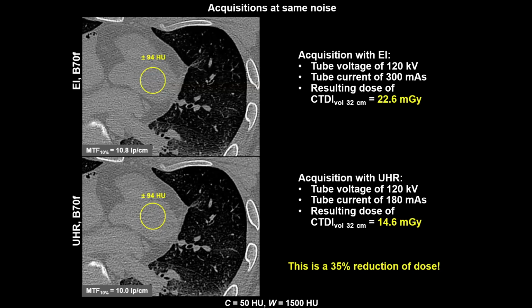As I already said, every patient can already benefit from this. Usually medical doctors are quite surprised when they see images with a very low noise level, because they always think, okay, you used a lot of radiation dose, but actually those are just images obtained using the photon counting system and using that small pixel effect that is available in these detectors.